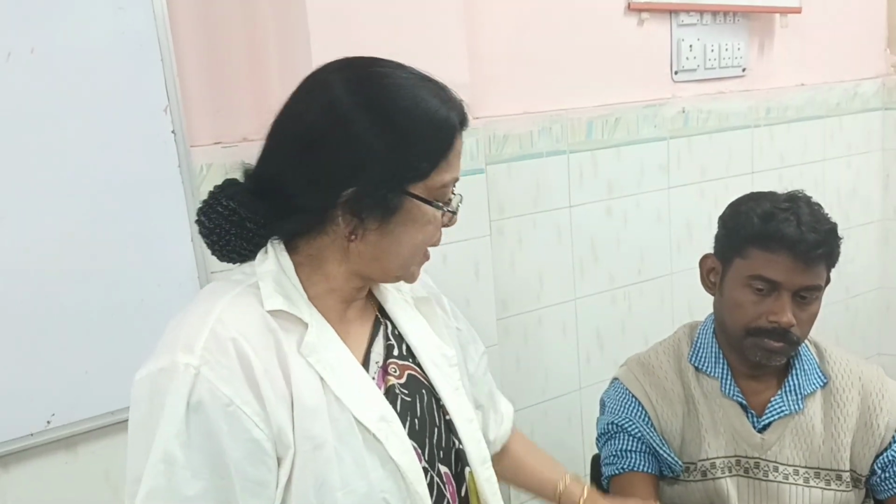A rough idea of SBP. Here the SBP will come a little bit later, because just on opening of the brachial artery, blood comes and we get the first taps. But sufficient blood has to come so that we can feel the pulse over the brachial artery. So there will be some gap, maximum 4 to 6 or 6 to 8 millimeter of mercury. This is less than the auscultatory method, maximum 4 to 6 or 8 millimeter of mercury less than that. So we are getting the first number, a rough idea of the SBP of the subject.